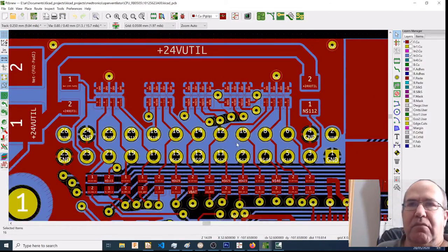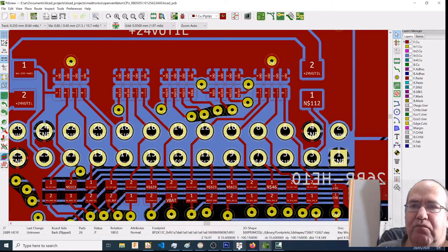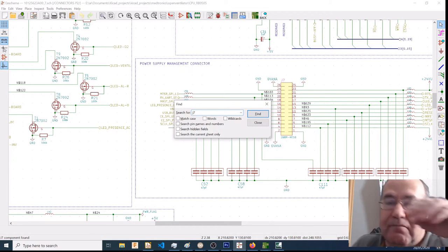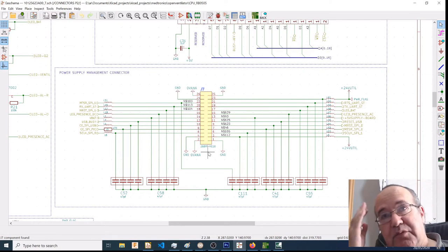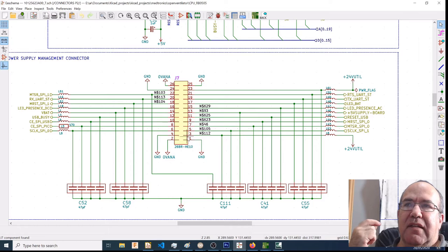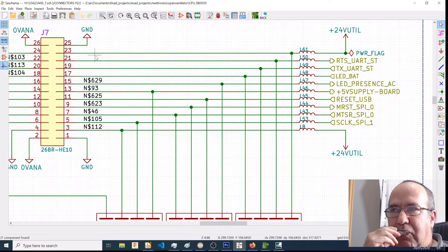Okay. I'm looking at connector J7. Control F, J7. Okay, J7 comes in. J7, which we said is the power into the board. The power into the board comes in from externally, and externally pin 3 and pin 23. Pin 3 and pin 23 are your power into the board.